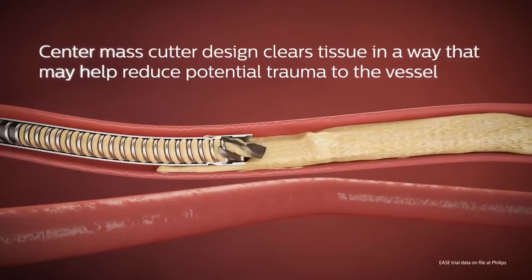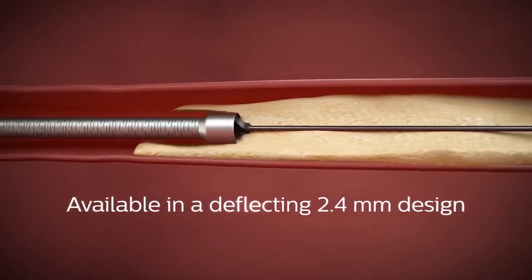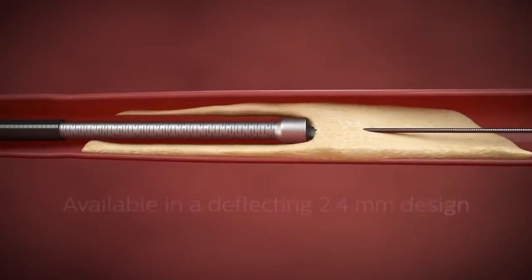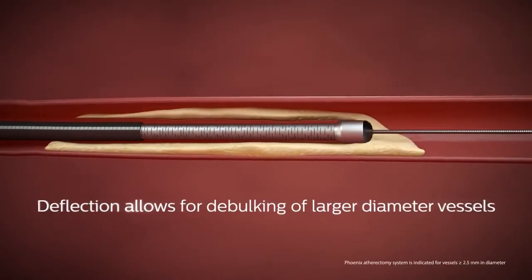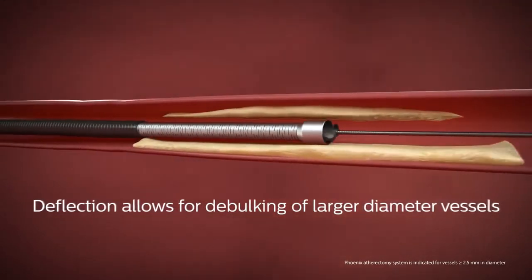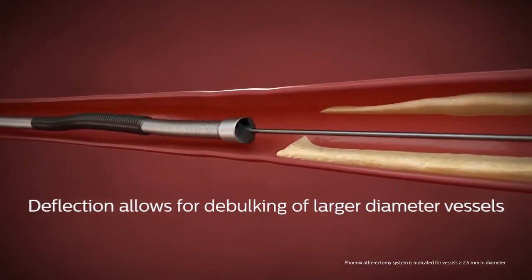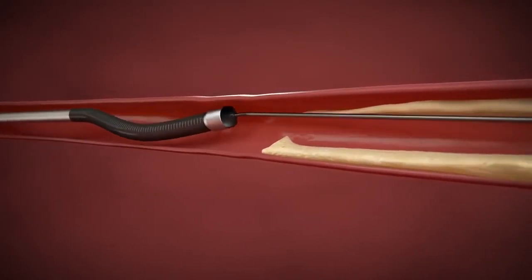The center mass cutter design clears tissue effectively and is available in a deflecting 2.4 millimeter design to enable debulking of larger diameter vessels above the knee. After creating an initial channel by debulking in a straight fashion, the catheter tip can be deflected and rotated as needed to achieve the desired result.